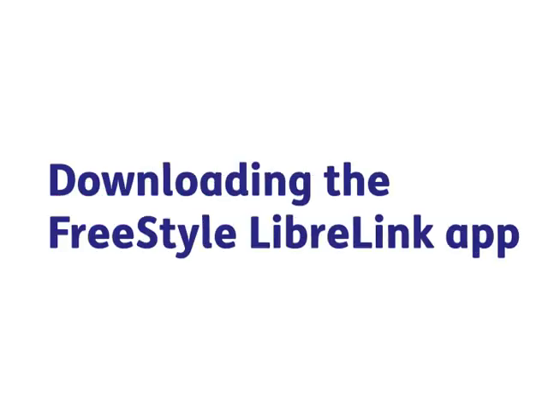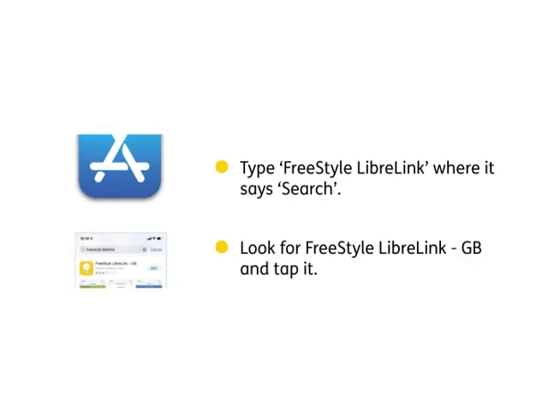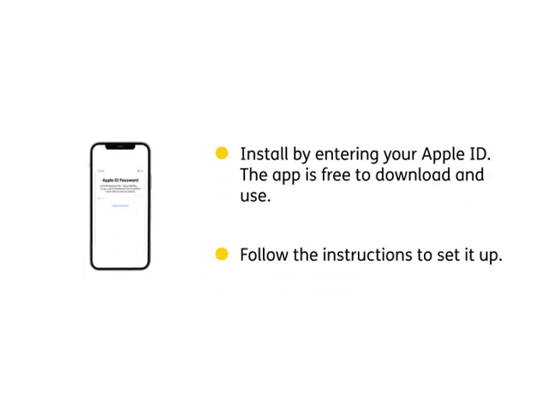Downloading the FreeStyle LibreLink app. Go to the App Store. Type FreeStyle LibreLink where it says search. Look for the FreeStyle LibreLink GB and tap it. Tap Get. Install by entering your Apple ID. The app is free to download and use. Follow the instructions to set it up.